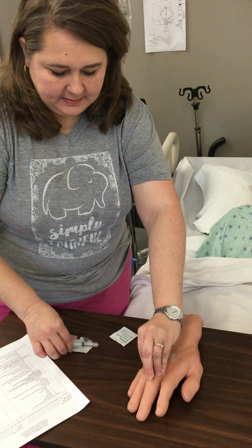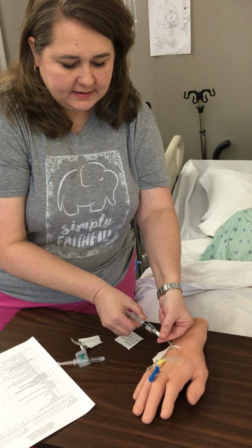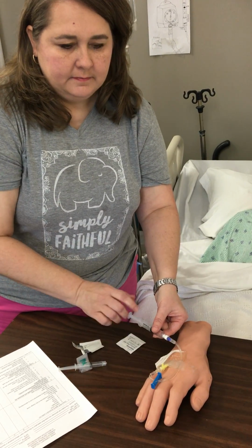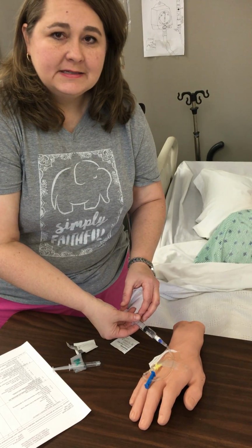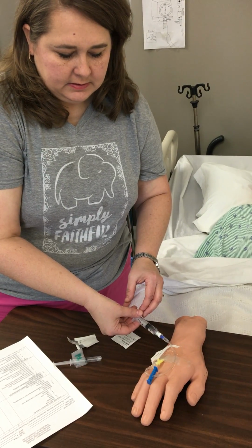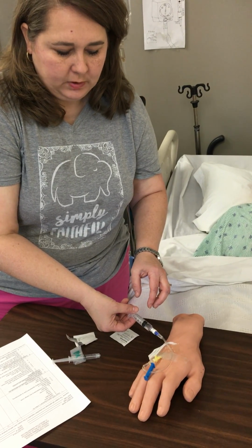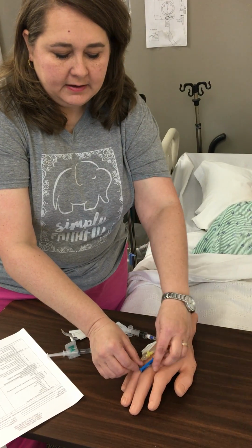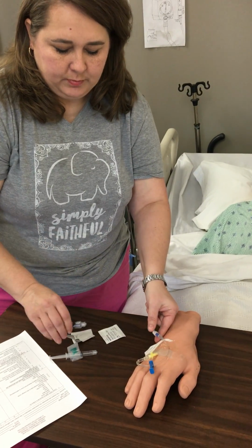Clamp my INT tube, or my pigtail. Apply my flush one more time, unclamp, and I want to flush at the same rate that I pushed my medication. So that should be a milliliter and a half over 1 minute. And we're going to time-lapse again. I want to clamp my pigtail or extension set and then remove my syringe.